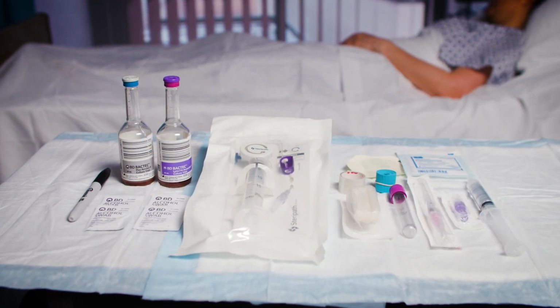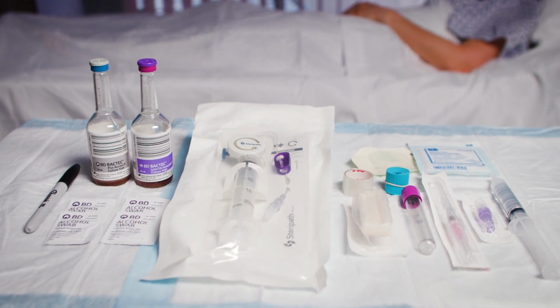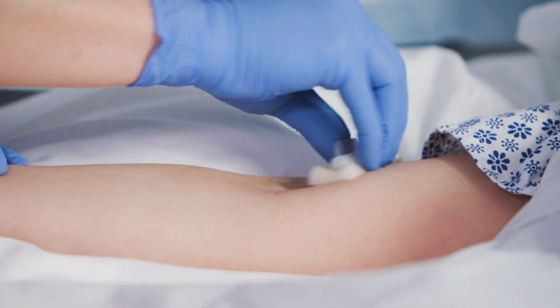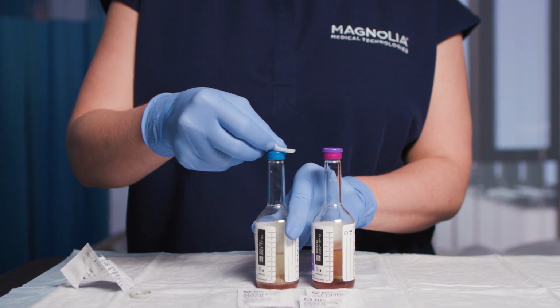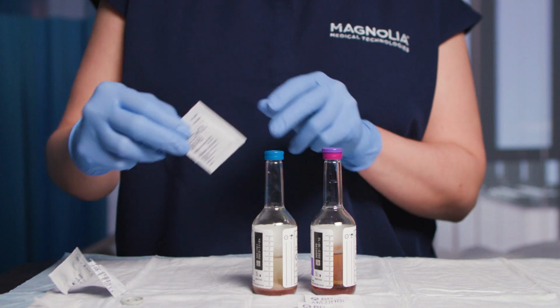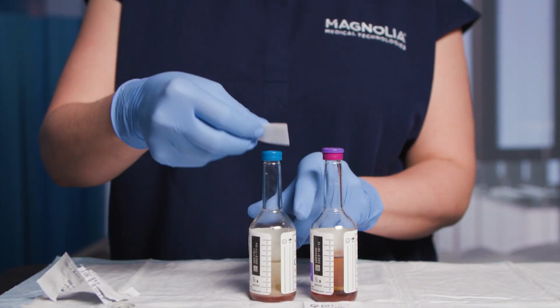Collect the necessary supplies, including Steripath Micro with integrated syringe in the Luer configuration. Perform skin surface antisepsis according to your institution's established guidelines. While skin antisepsis is air drying, thoroughly disinfect each bottle top with an alcohol prep pad. Scrub for 15 seconds, let air dry, and leave a new pad on top of the bottle.